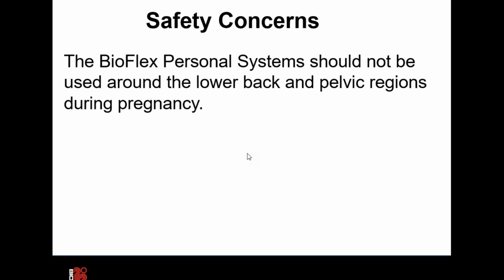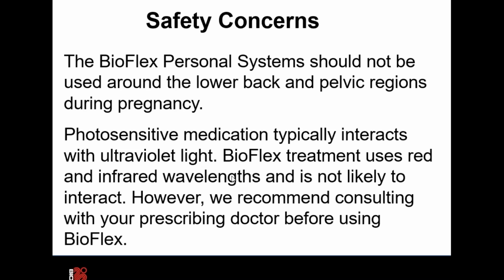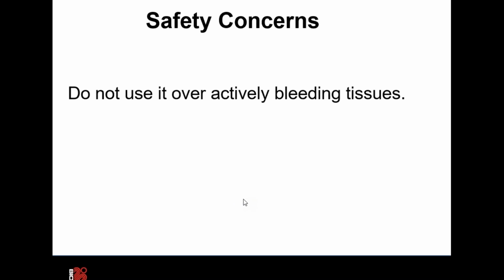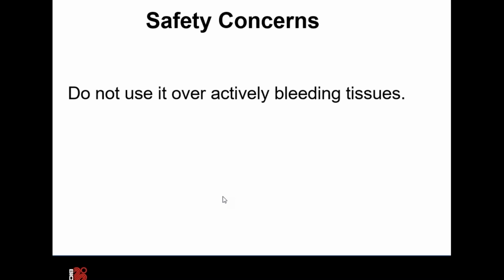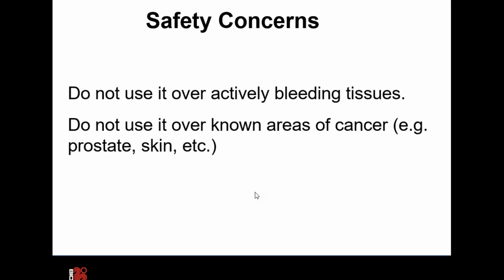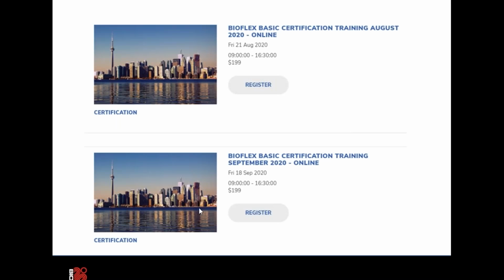They should not be used, and I know we're doing the knee and the hip, but just so you're aware, they shouldn't be used around the lower back and pelvic regions during pregnancy. And you don't need to worry, there's no interaction with these wavelengths and photosensitive medication. These medications interact more so with ultraviolet light than they do with near infrared and red light. But again, if you're not sure, I would suggest you talk to your family doctor or the doctor prescribing in order to make sure everything's okay on that end of things. Don't use it over actively bleeding tissues, obviously over areas of known cancer as well.